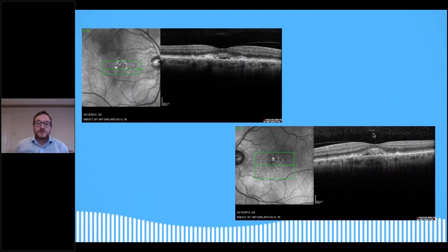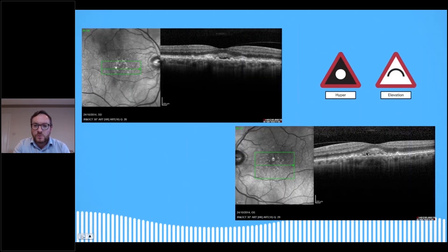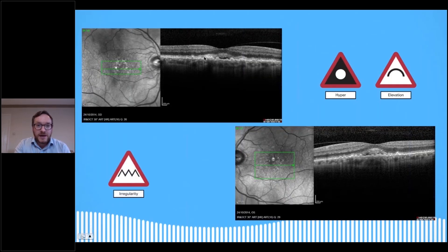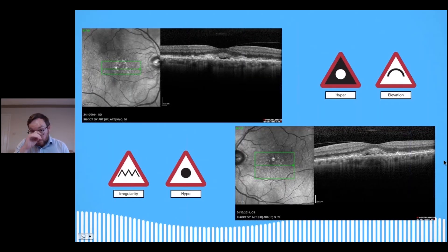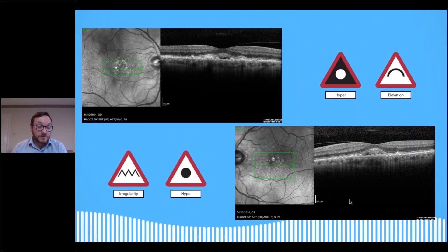And this is what we got. The top image is the right eye, the bottom right image is the left eye. Using the iWay Code, what we can see is areas of hyperreflectivity on both the infrared images and also underneath where we've got the drusen. We've got elevation within both retinas. We've got areas of irregularity in both retinas, and we've got areas of hyporeflectivity in both retinas. Despite the fact that the patient is 6/6 plus or minus in both eyes and was asymptomatic, I was concerned with the hyporeflective areas. I called up Chesterfield Royal, sent them over the images, and they agreed it didn't look quite right. It was confirmed that he'd got wet macular degeneration in both eyes — bilateral, basically same time onset.